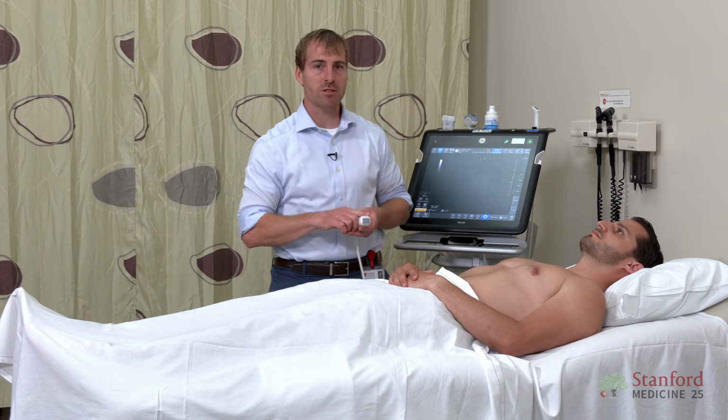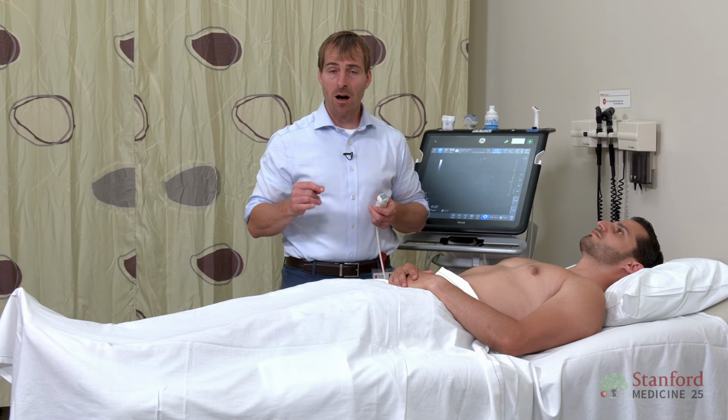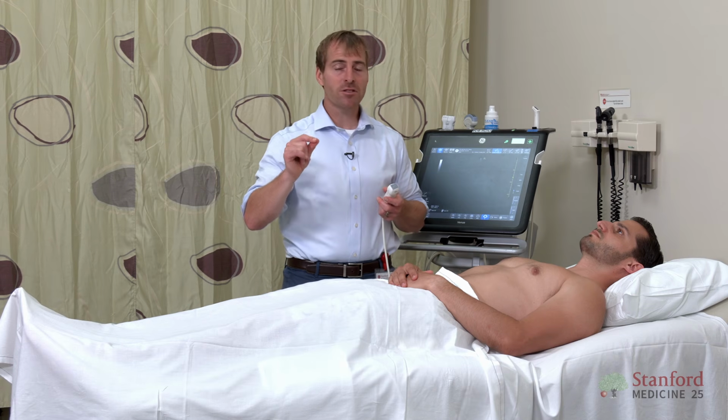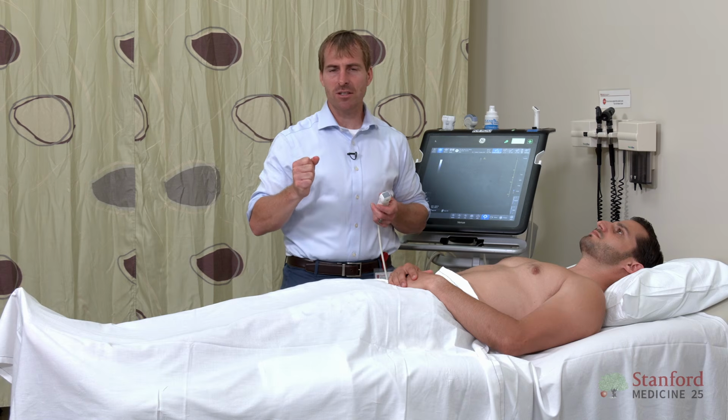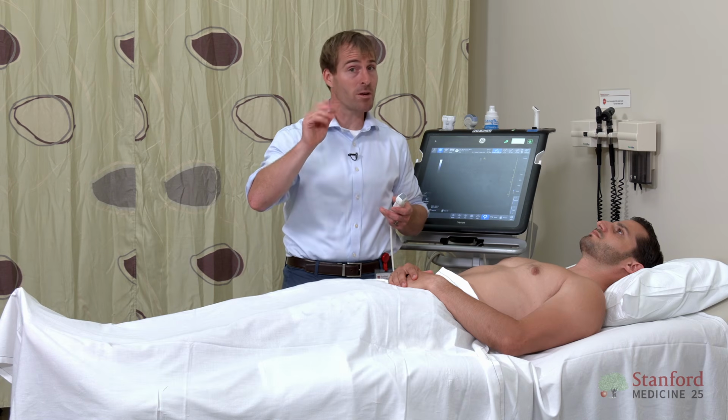You're looking at patients with sepsis, right? Where sometimes you actually have trouble finding the IVC because it's completely collapsed. I've seen this over and over again. We're searching and searching for the IVC, and it's completely collapsed. You can actually have the patient just do a little Valsalva. Sometimes it pops open, and you can identify it, all right? You know that that patient's CVP is low, all right?